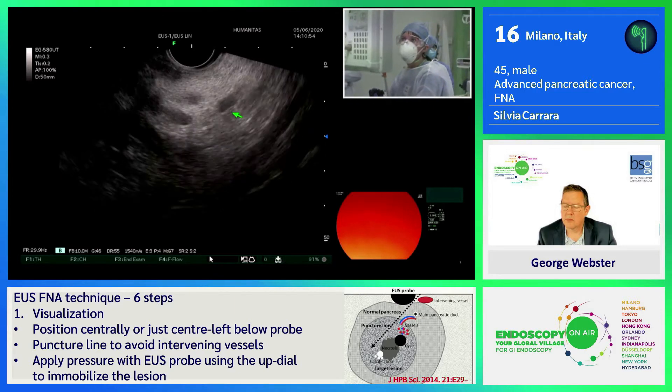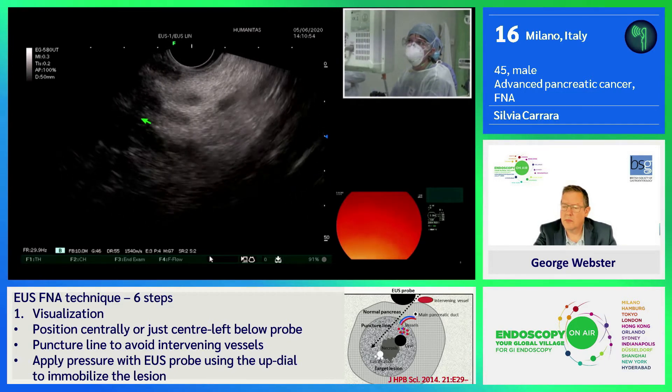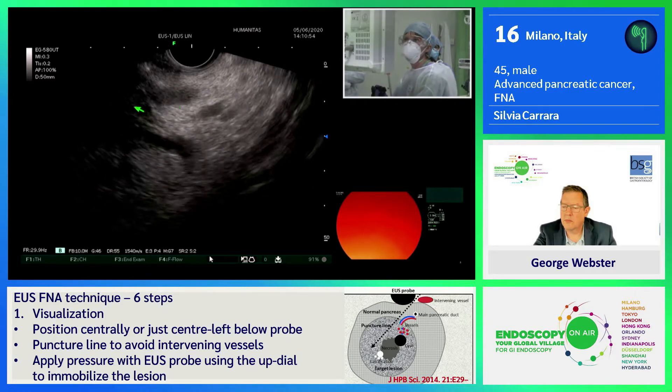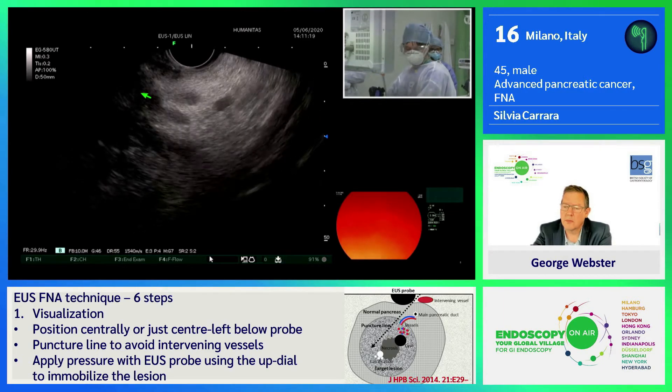The patient also has portal hypertension due to infiltration of the confluence. We can appreciate the tumor and the thickening of the vessel. I'm positioned very deeply in the second portion of the duodenum.